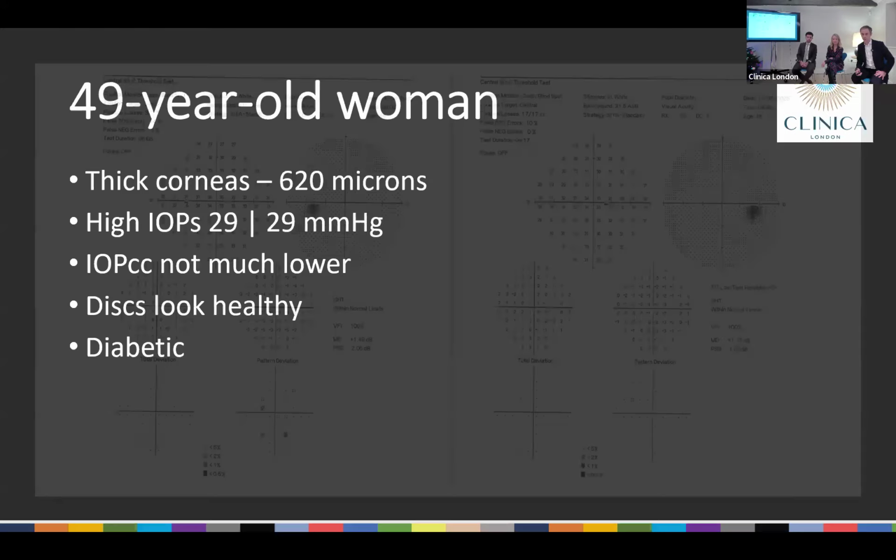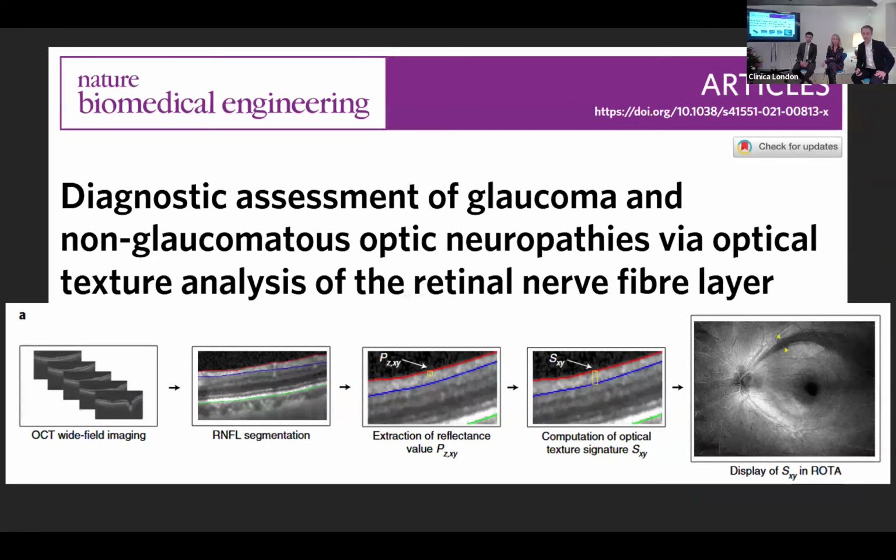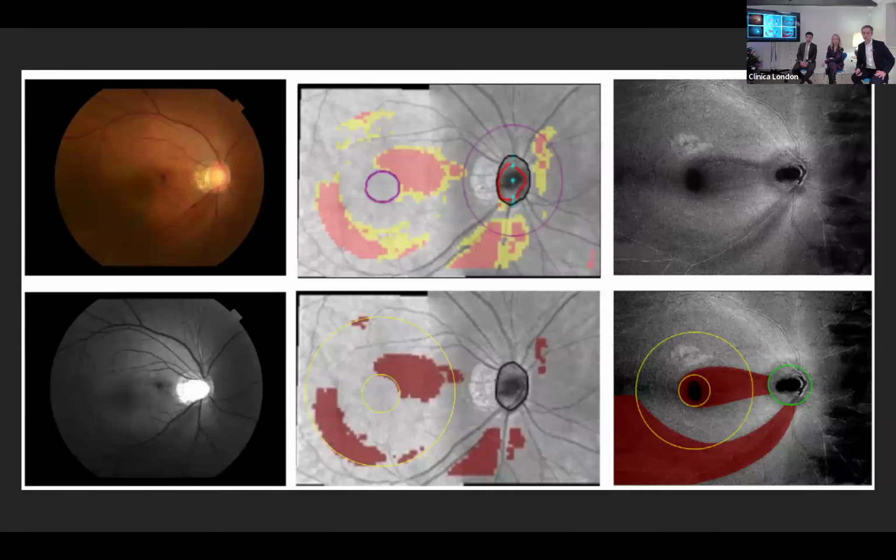Yes, and there is one quick question, and it's sort of related here. Can you explain BMO and the significance of it? So BMO is Bruch's membrane opening. Essentially, one of the problems when you're trying to measure the disc and cupping is what's the reference plane. The previous device, the Heidelberg HRT, the Heidelberg retina tomograph, used to just take the height of the disc at the temporal margin as the reference point. And the problem is it can really vary, especially when you've got sloping rims.